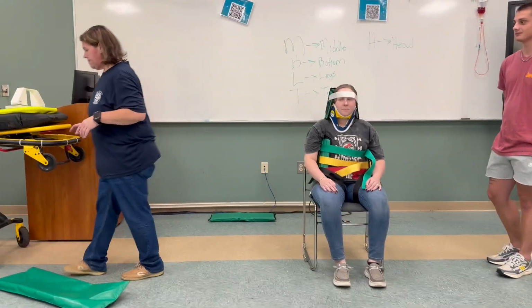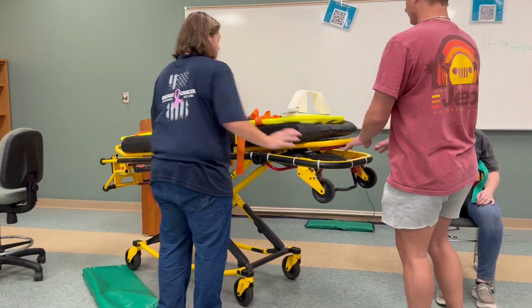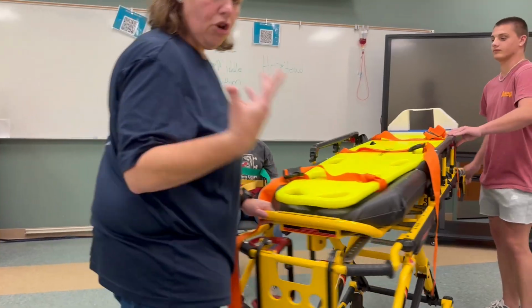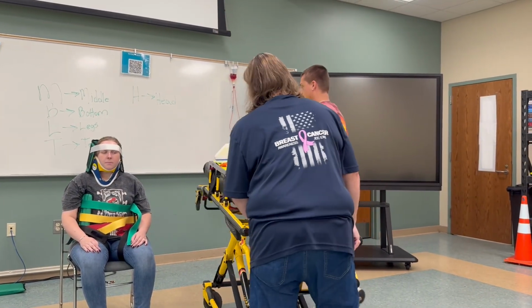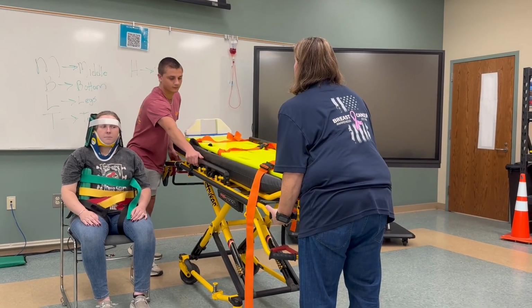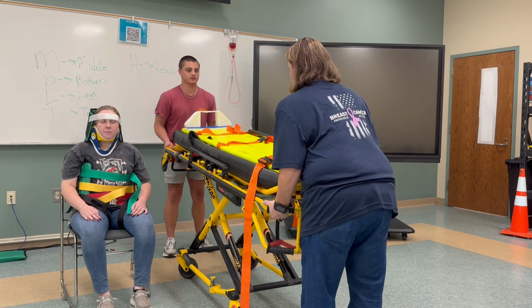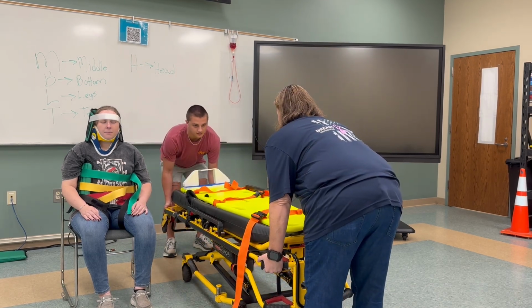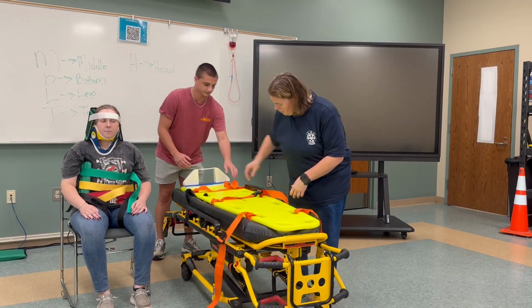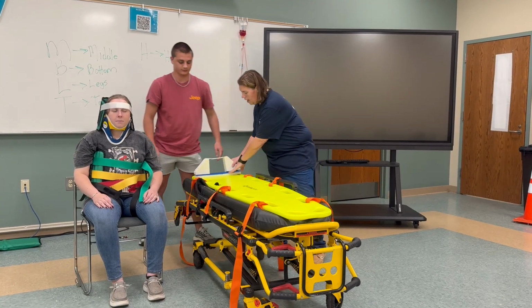So me and my partner are going to grab our stretcher and our backboard. And we'll go right beside, it's hard to show you because I don't have a car, but we'll go right beside the patient. I'm going to count it. Your count? 1, 2, 3. All right, right here. So now, after you have a patient placed on the KED, you will utilize a backboard to transport the patient to the hospital.